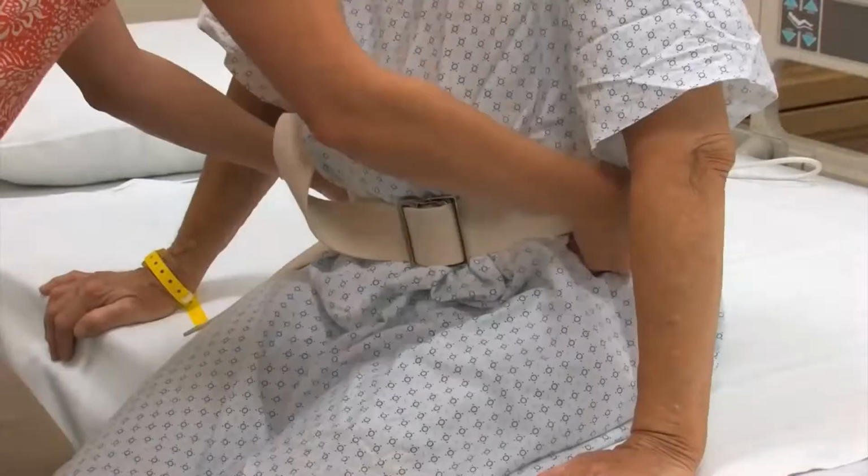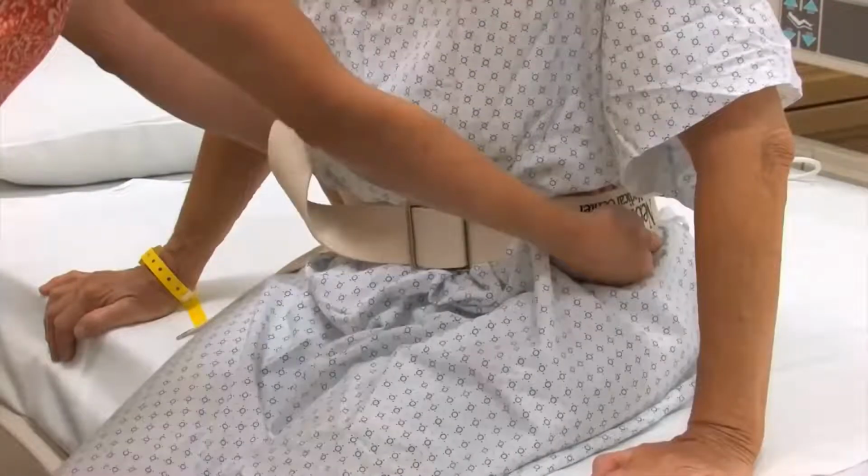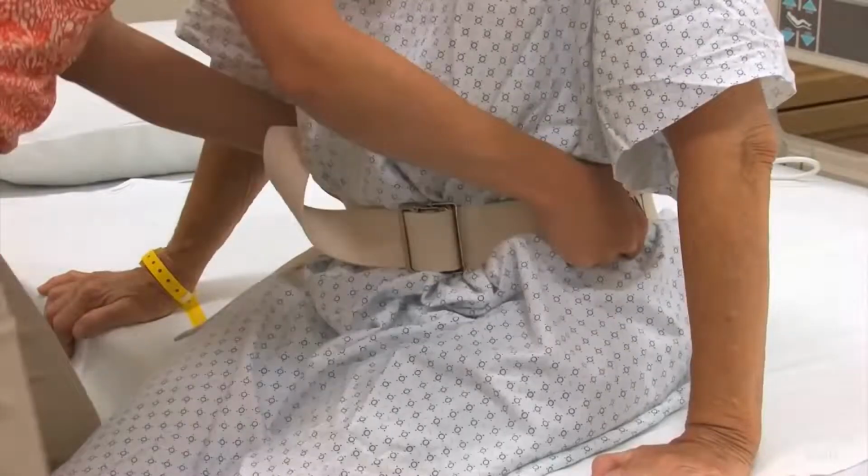When holding onto the gait belt, grasp it so that your fingers are coming up under the bottom edge of the belt. Don't hold it from the top edge. If the patient begins to fall, you will likely lose your grip if your hand is positioned this way. Next, you'll see how I'm using the belt to assist the patient into standing.